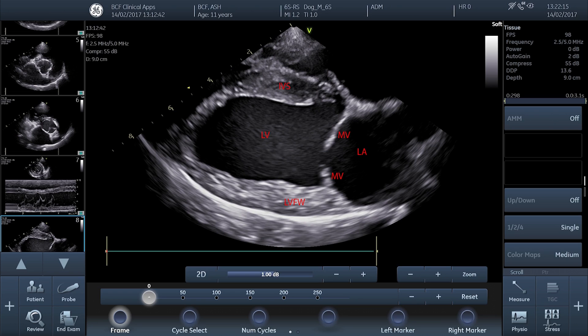Once you're happy you've got the view optimized, allow a few cardiac cycles to pass before saving a cine loop. Once you've got the cine loop saved and you're happy with it, then carry on and make the measurement.